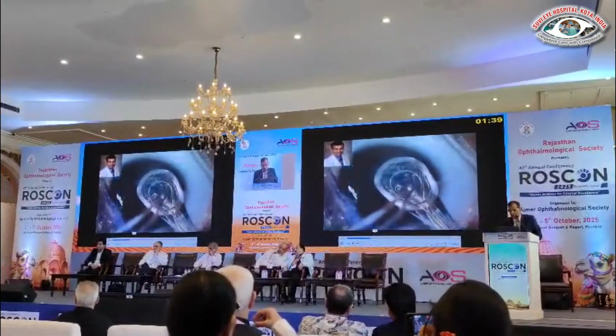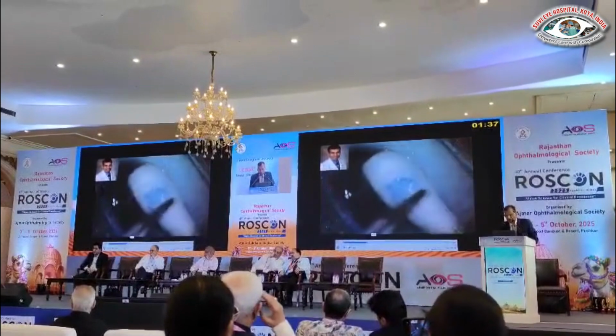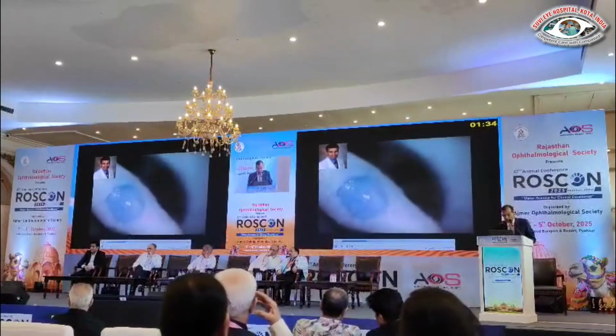So this is one of the very innovative devices which can be helpful to manage pediatric cases and hypermature cataracts. This is the capsule access being done with the Zepto device.